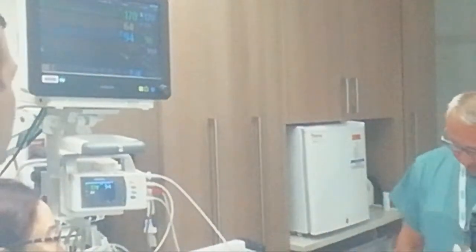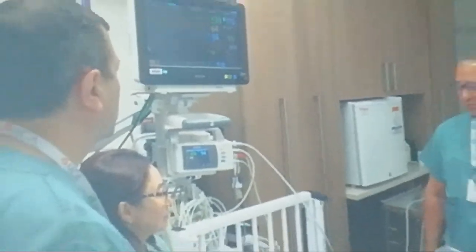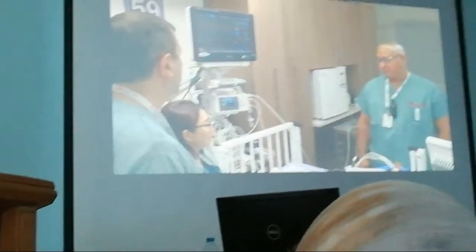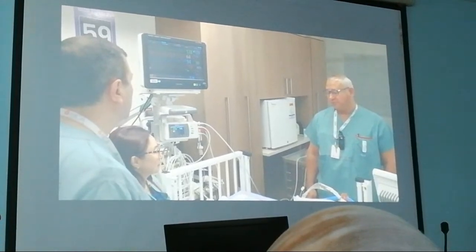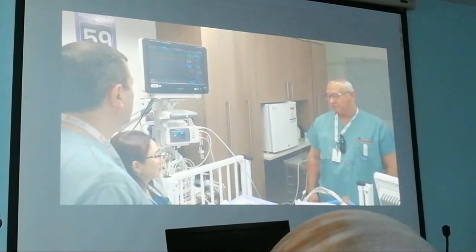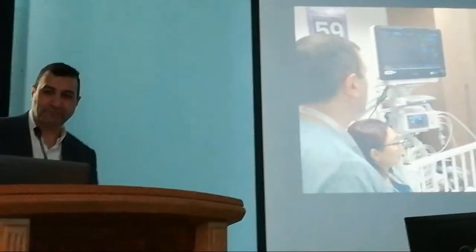So you remember the 1%, how much time? If you have the day in minutes, 1% is close to 15 minutes. So when you have 5% in the hypoxemia range, below 80%, that's really significant. It means that you have more than 1 hour of cumulative hypoxemia time.